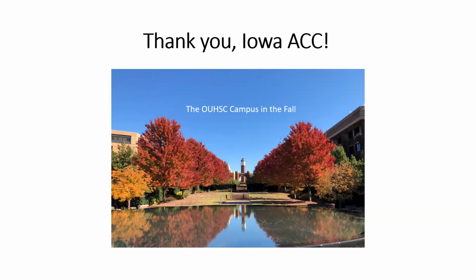How about commenting on having prior pulmonary hypertension and now developing tamponade? Yeah, that's a very important question. I forgot to add that, particularly with right ventricular free wall early diastolic collapse, which we have mentioned more than once, as a very important, probably the most helpful echo finding in tamponade physiology.